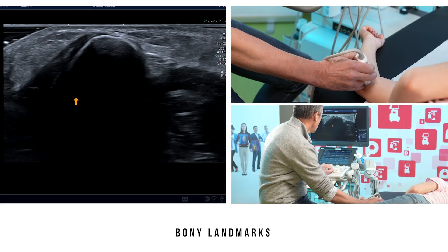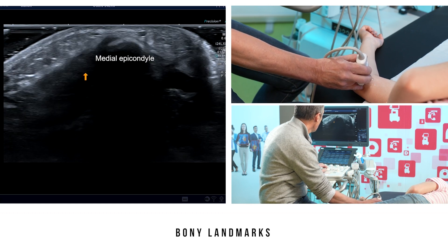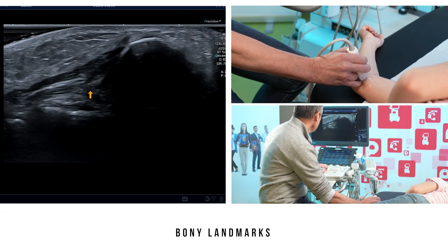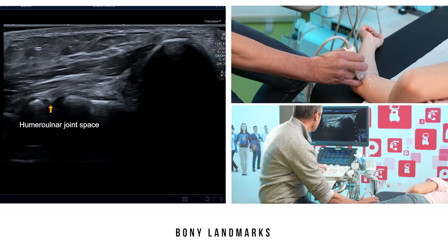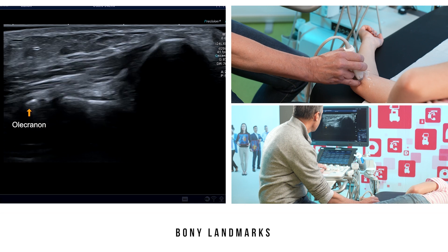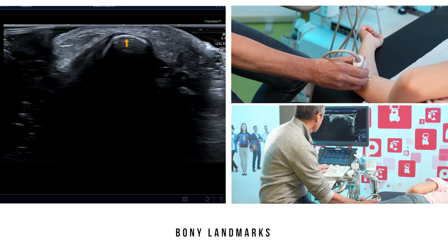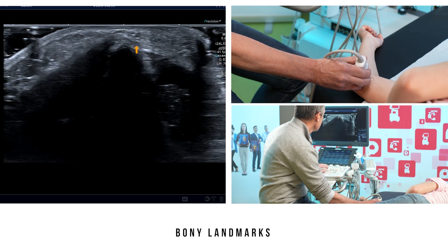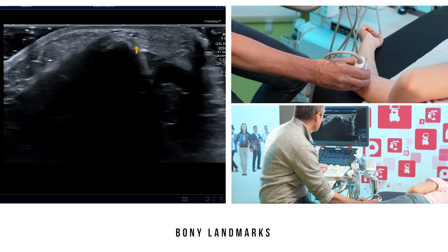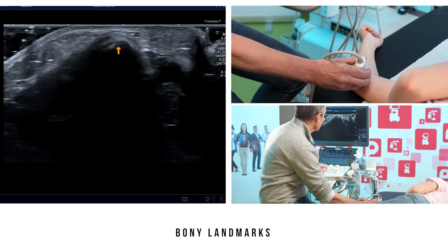The exam always starts by locating the bony landmarks. It is easy to locate the very noticeable bump of the medial epicondyle, which is rounded. Using the frontal section, we can see the inferior humeral cortex and the humeral-ulnar joint space, clearly visible here, with the olecranon above the arrow. Repositioning the probe under the medial epicondyle, if we go up, the cortex gets thinner and sharper, corresponding to the supracondylar ridge, another tendon insertion site.